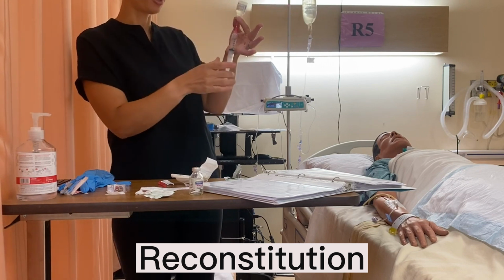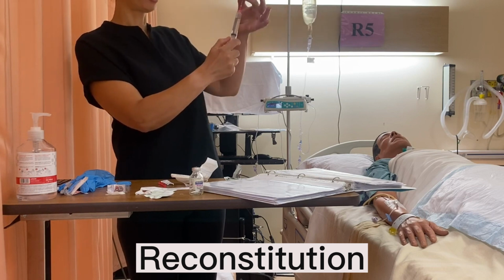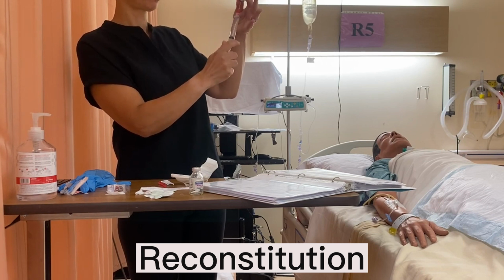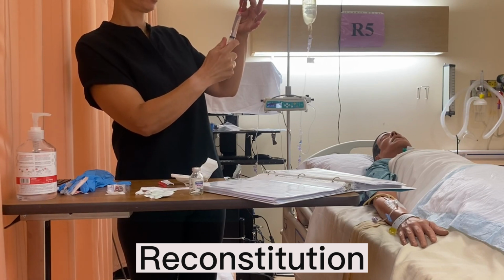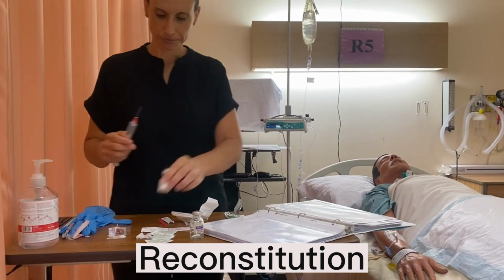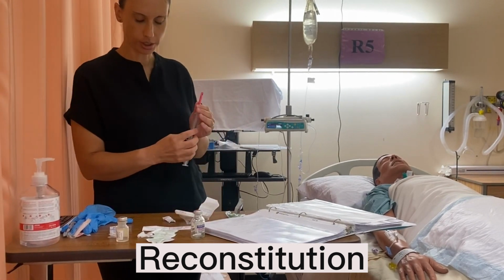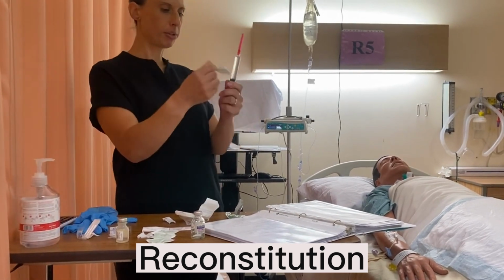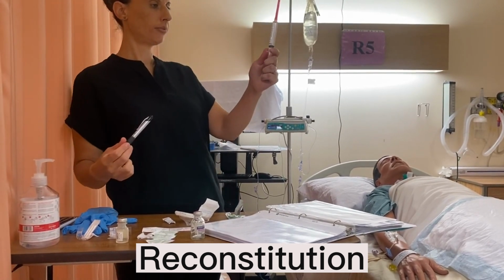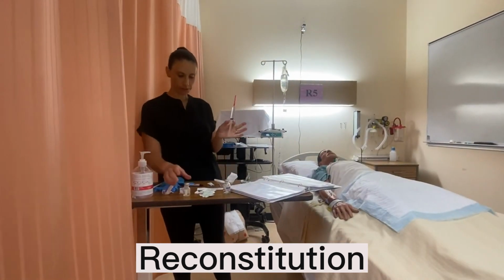So it's going to equalize the pressure. It's going to pull back on that sterile water. You can keep pulling back and then you can add a bit more air. Maybe just a little more than 10 mls. Scoop and swoop there. And then we're going to tap out the bubbles. There we go. Good. And then we're going to make exactly 10 mls of our sterile water.